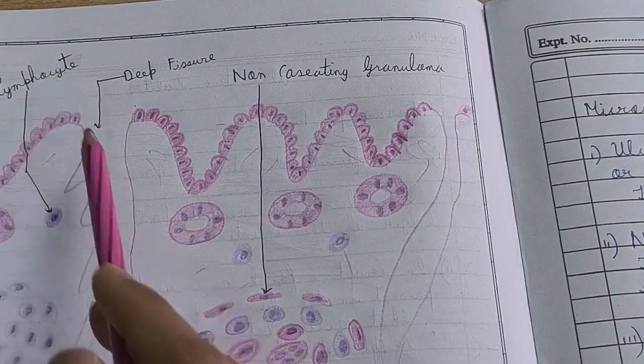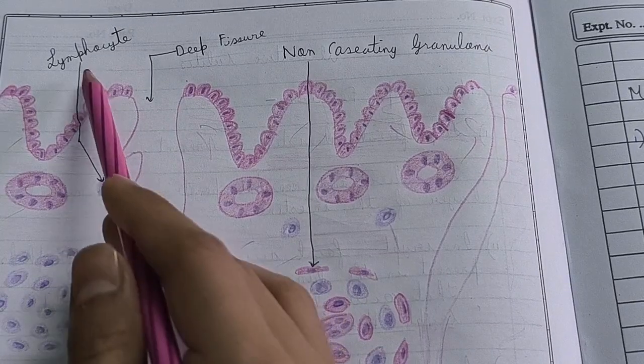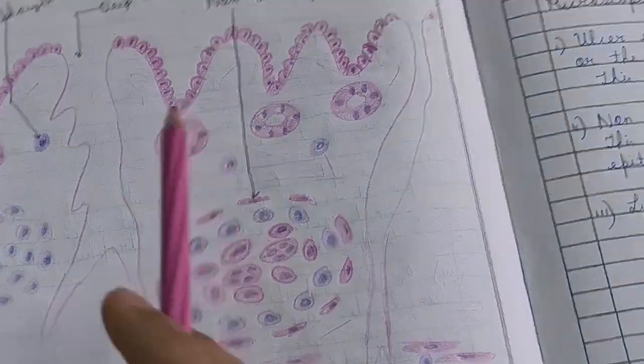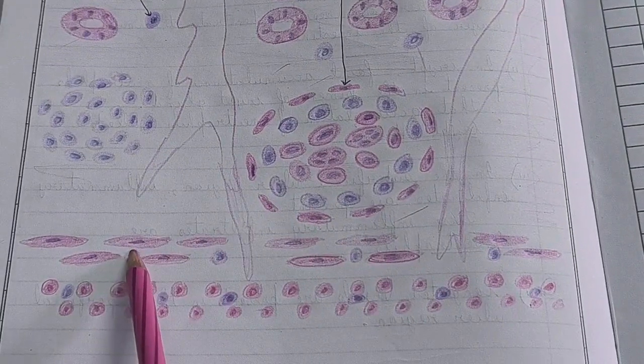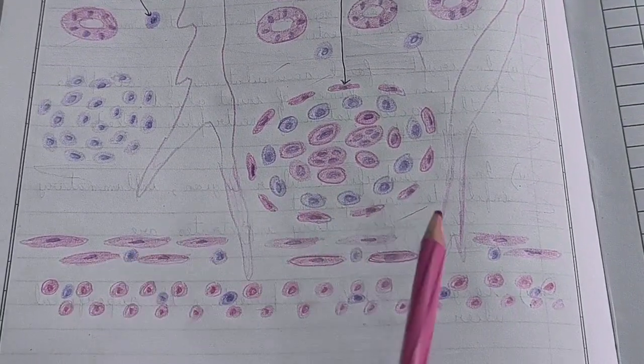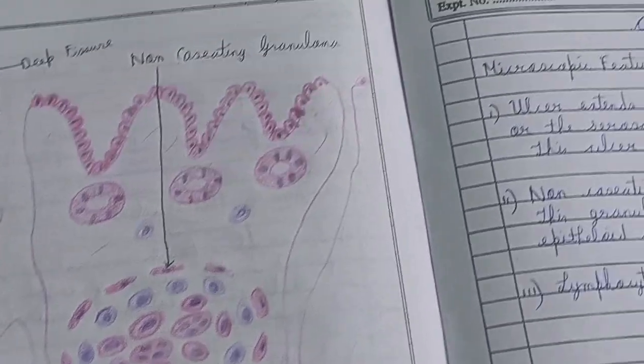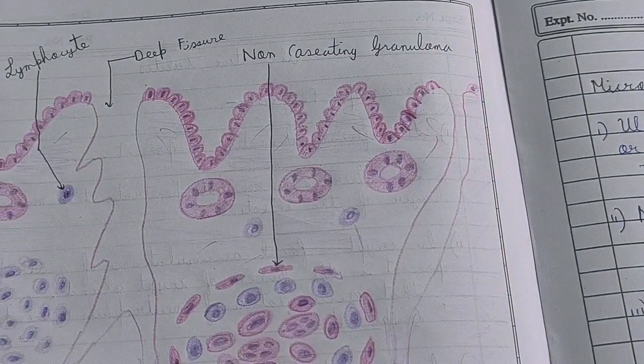And see that in all four layers lymphocytes are present. This is the lymphocyte in the submucous layer, and in the muscularis mucosa also lymphocytes are present, and in the serosa layer also lymphocytes are present. So lymphocytes are present in all the layers.